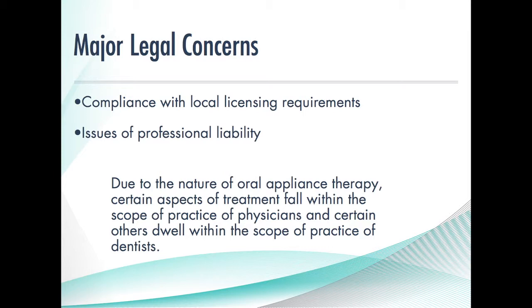So some of it falls in a very gray area, and like I said, I've been doing this for a long time. It started with treating TMD patients. I would see a lot of these patients, and part of my protocol, and we'll go over them as we get through the slides, is doing cone beam CTs on people. As we're seeing the TMD patients, they come in with a similar profile, retrognathic, class 2, 4 bicuspid extraction, and we get a sagittal cut of their face, and we look at their airway, and they've got like a 1 millimeter airway.